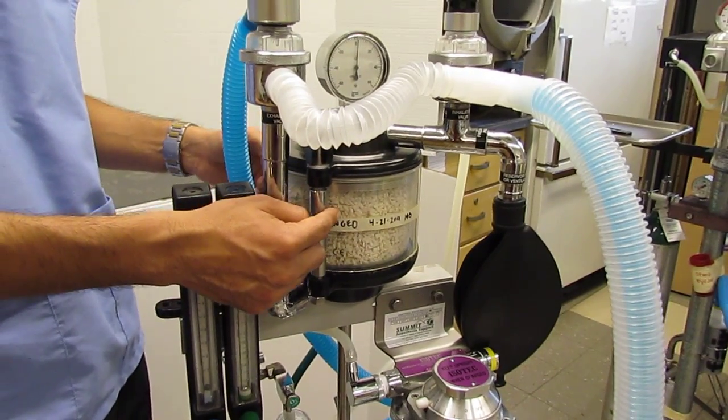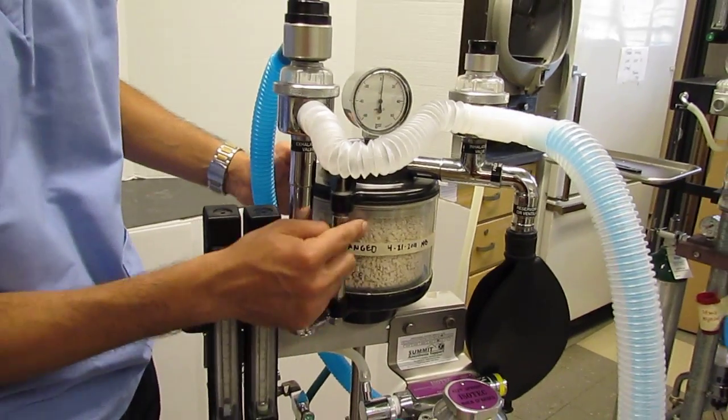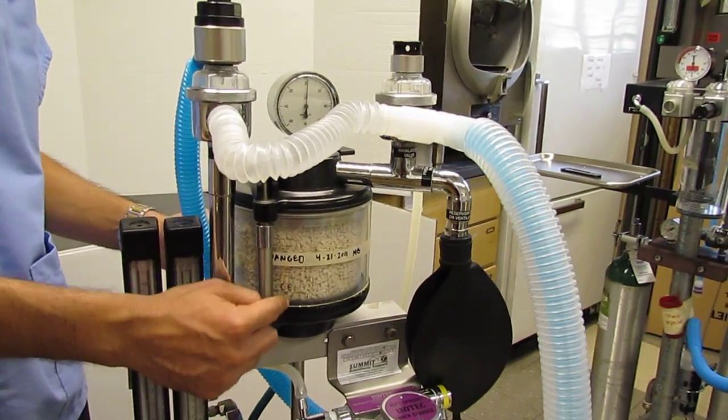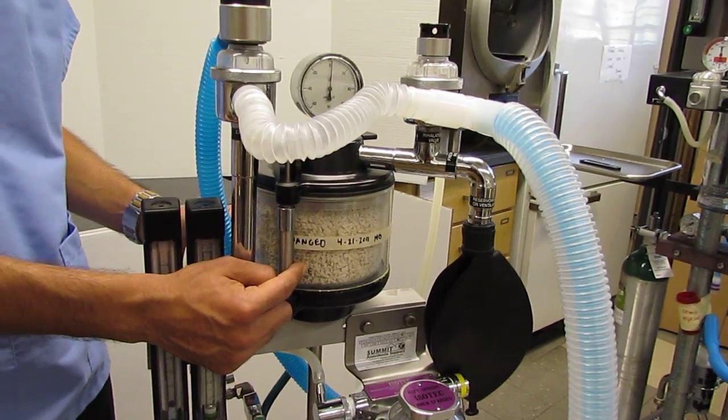But beyond that, we also have a color change that occurs. When in use, for isoflurane, when in use, you will see that the colors of the granules turn from white to about a violet or blue.